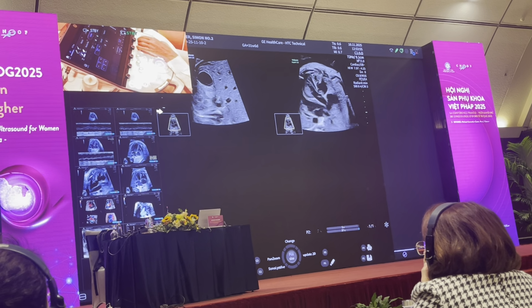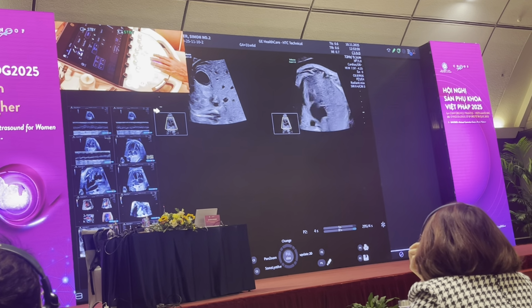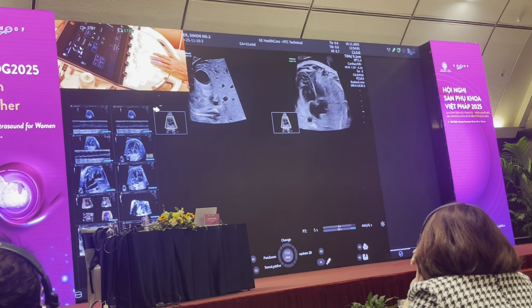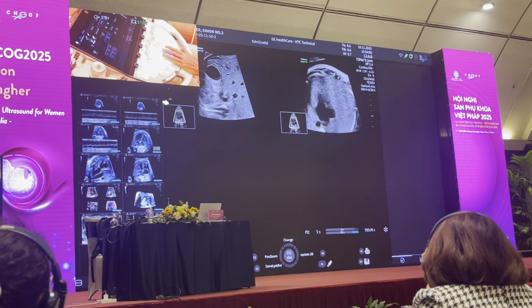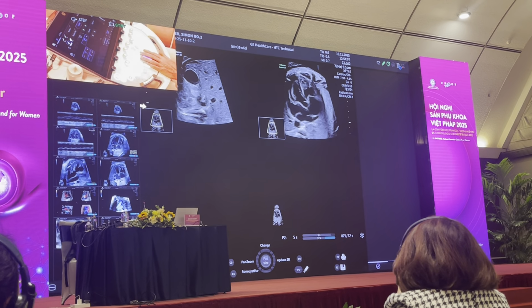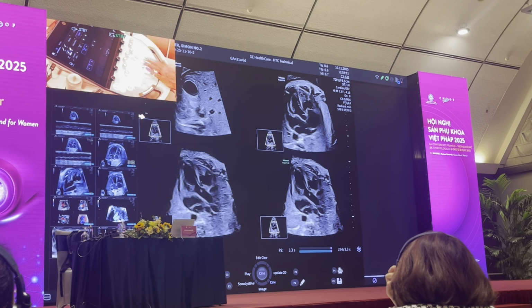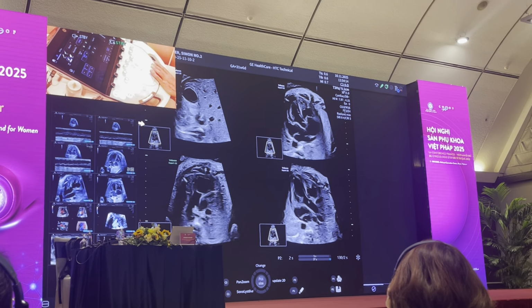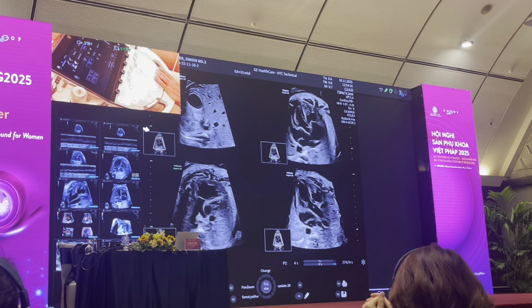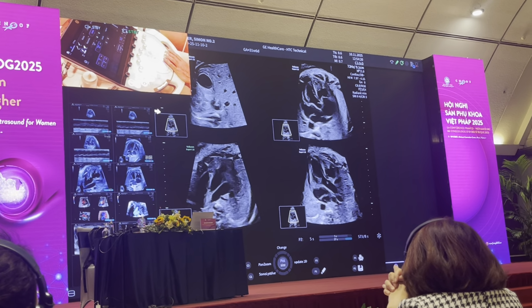There's no pericardial effusion. You see the pulmonary veins empty normally, normal chambers, normal AV valves, normal foramen ovale. And then I go next to looking at the left ventricular tract. And then next I go to looking at the right ventricular tract and show the right ventricle, pulmonary valve, aorta, SVC, right pulmonary artery, and then after that the three-vessel views.